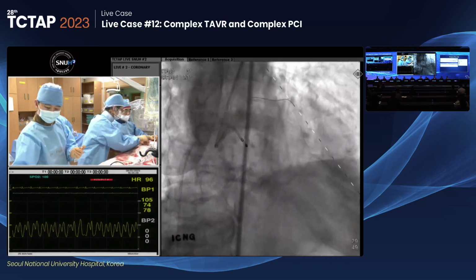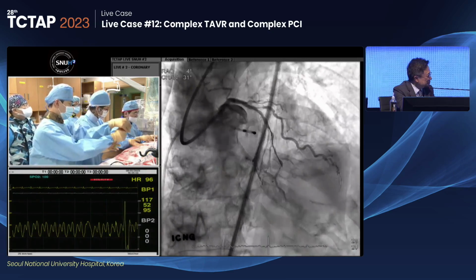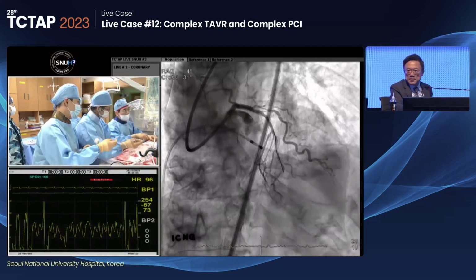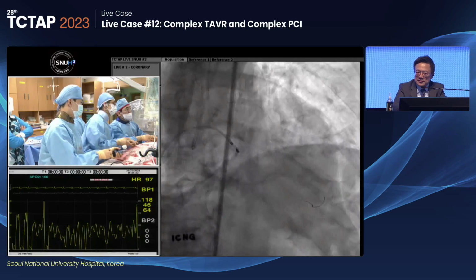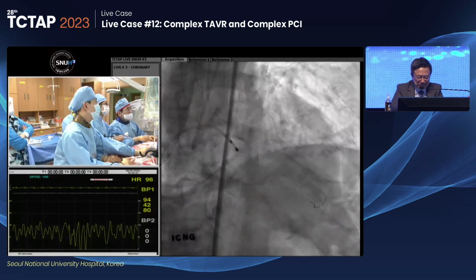I think if you were in the States, at this point, you would put a laser in, because the balloon is not going to blast through. What do you think about the laser? If you have a laser, I do laser with contrast. But we don't have laser anymore.